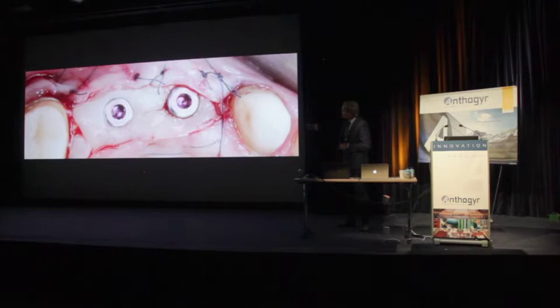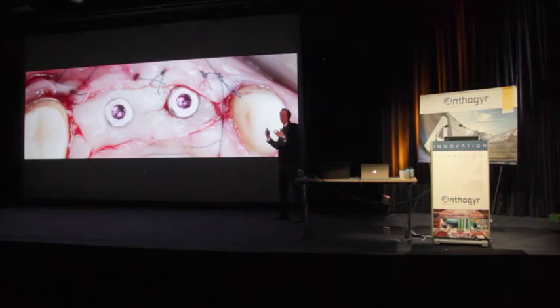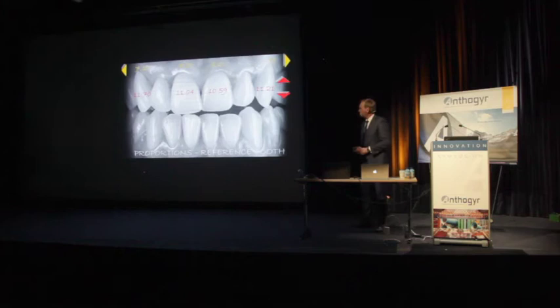So the whole package is going to give me a boosted biotype. Thick tissue is a must. So that was in the healing period. Then I do an analysis of the tooth proportions. I want to restore this case with golden proportions.